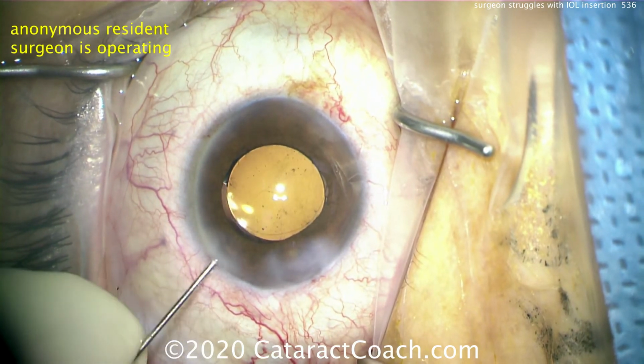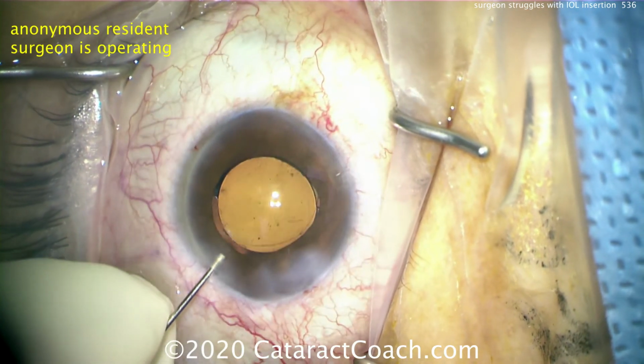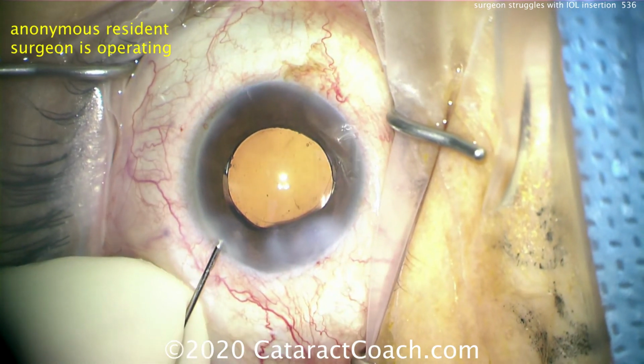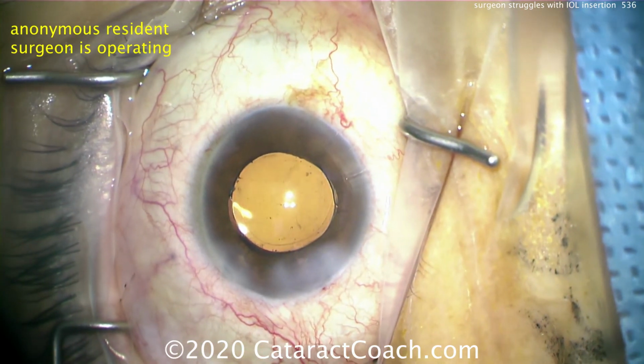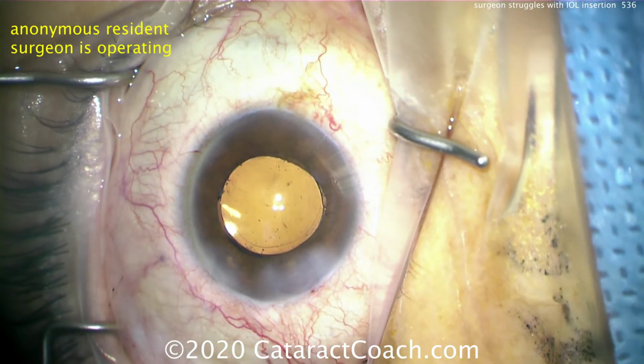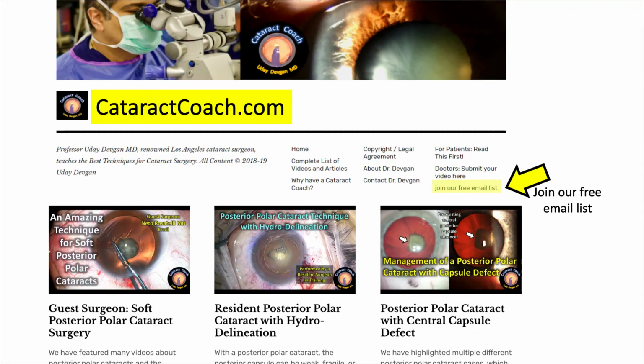Do not leave one haptic in the sulcus. That'll be a huge problem. And also prevent the issue. As you saw in the beginning of the case, when you're positioning the lens, don't lose viscoelastic. Pivot gently in the incision.